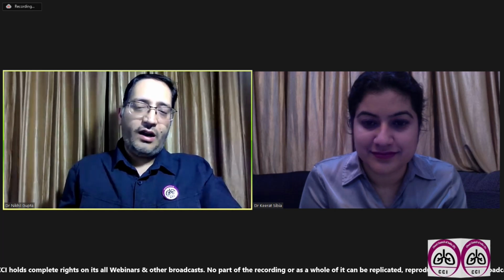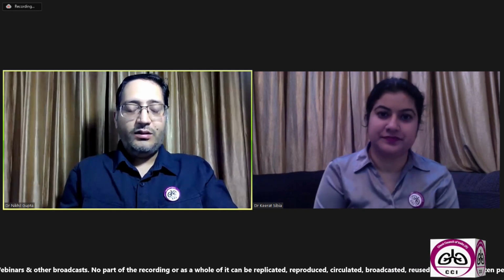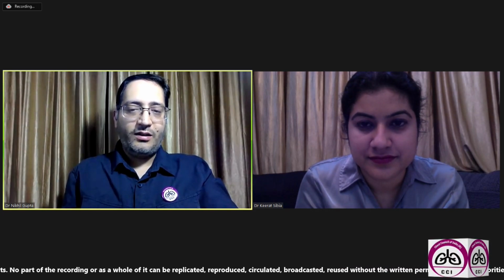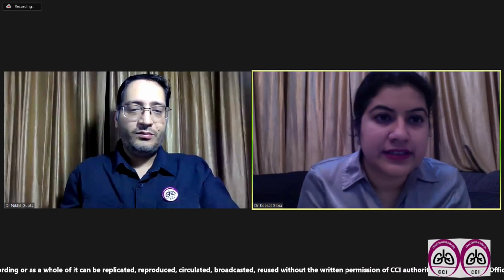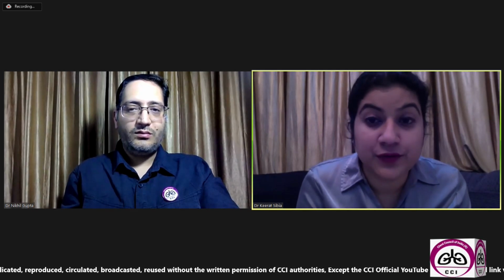Over the left heart border, so it can mimic pneumothorax on an AP view. So we do a lateral decubitus view to differentiate, or CT, generally CT can be done. So I think the Mach effect can also be confused or mistaken for pneumomediastinum, because there's air at the left cardiac border. It looks like there is air, but it's actually just a dark strip, right?